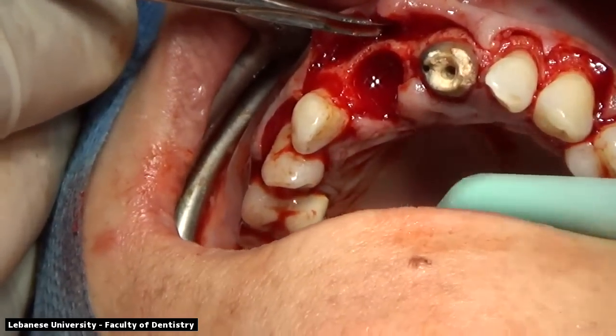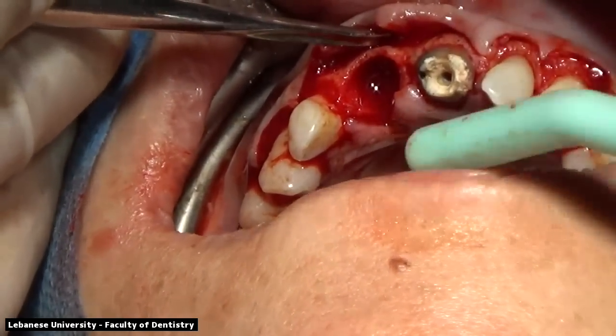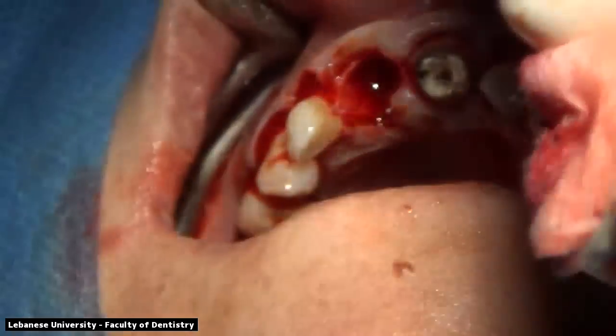We are examining the buccal plate of bone and the socket. We can see that there is some bleeding. We have a very thick buccal plate of bone, an intact buccal plate of bone. There are no fenestrations or dehiscences or any defects in the bone.